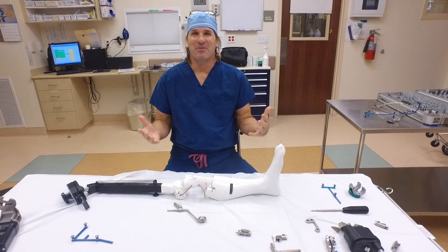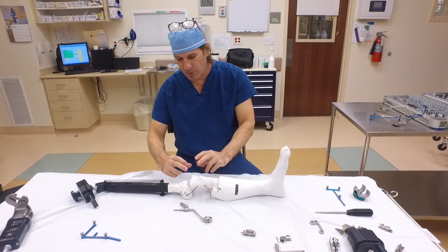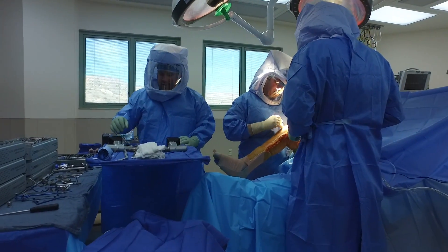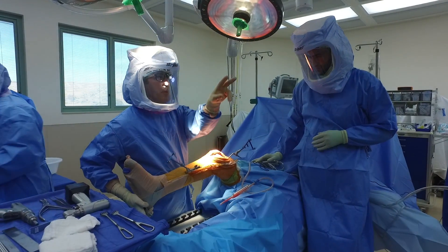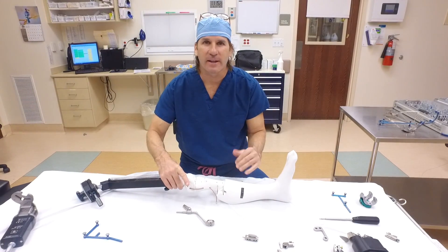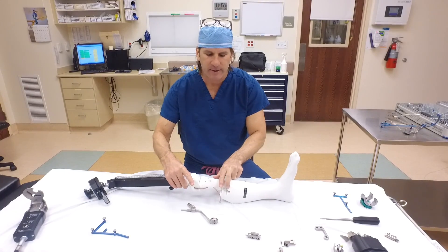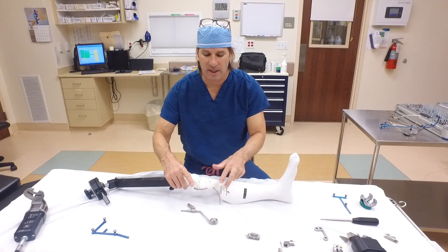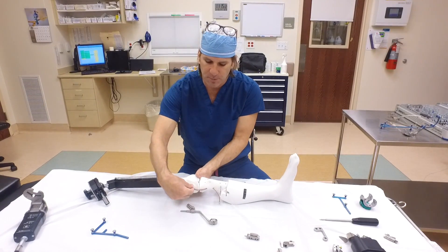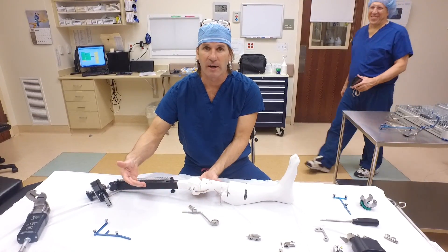When we're doing the robotic knee, our approach is going to be the same — a midline incision, move the kneecap out of the way, and clear some of the tissues in the front. Then the robot has to know exactly the alignment of the bone. So we're going to drill two pins into the shin bone through tiny little stab incisions right here. The two pins that we put into the femur just come through the original incision right here.